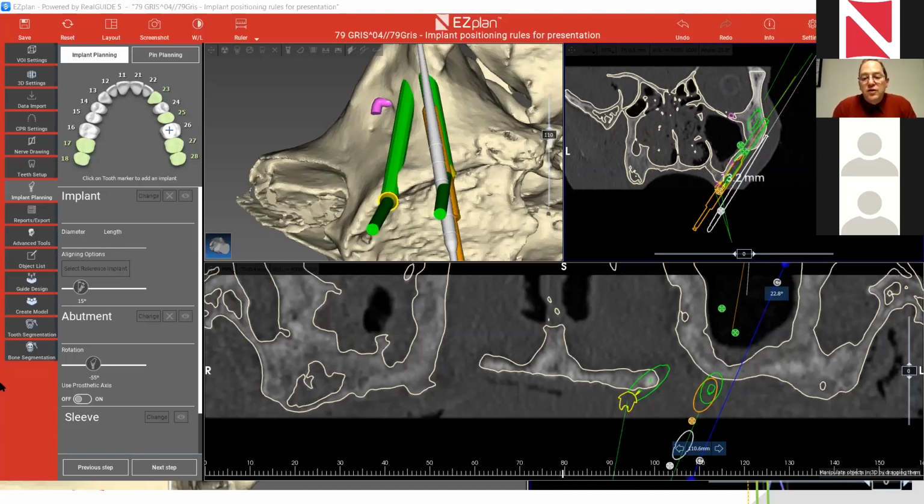Even if you have tissue resorption, the area is not infected and it is very easy to clean. And this is one of the advantages of this kind of surface finish versus other implants that have thread all the way toward the crest.